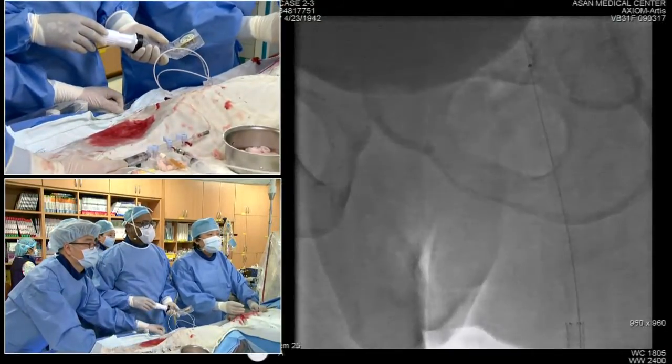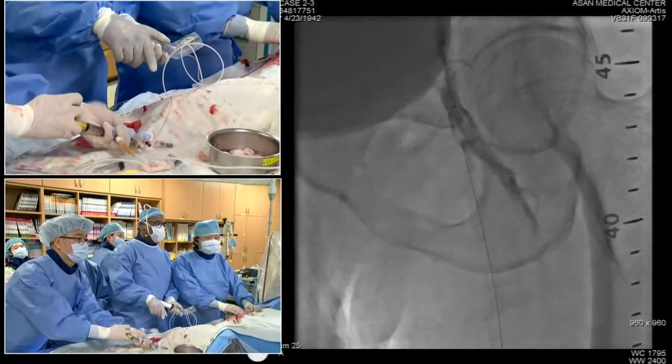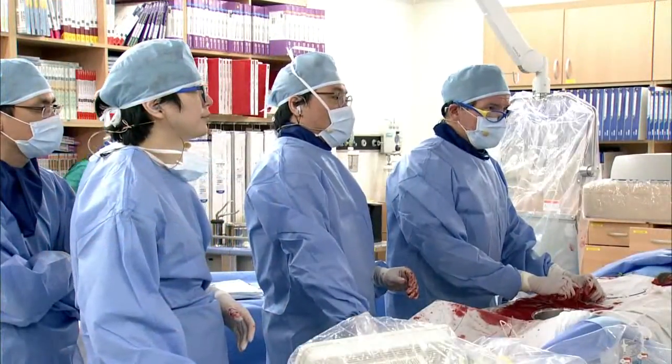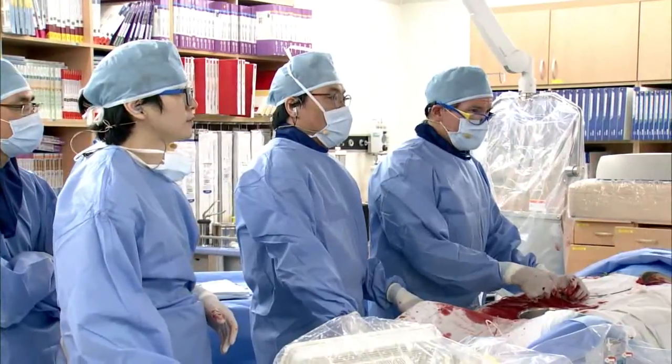Okay, we'll switch to the next room, if possible. Hey, John. Hey, Rich, we're back with you now. Yeah, John, we're still struggling over here.